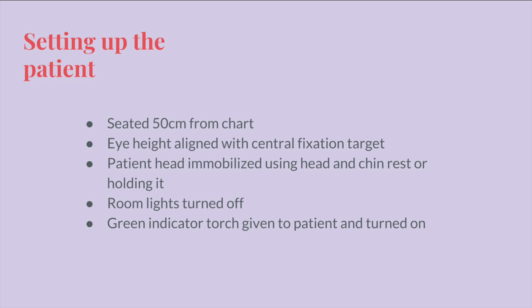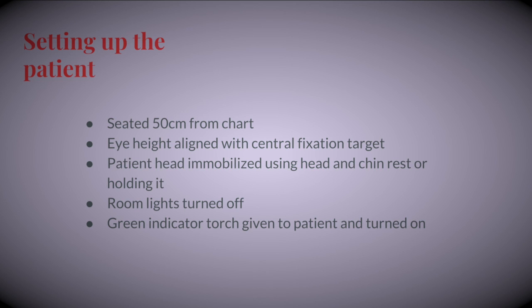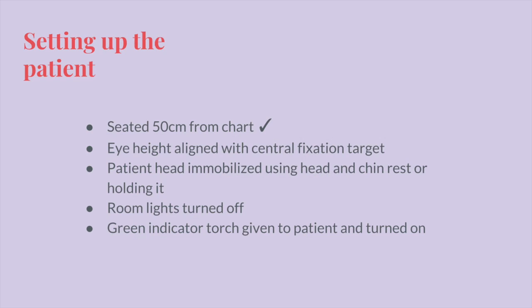The test needs to be explained to the patient, and they need to be given the green indicator torch. The goggles are then placed on the patient's face, ensuring that they're a comfortable fit and not too tight. The room lights also have to be turned off or at least dimmed.